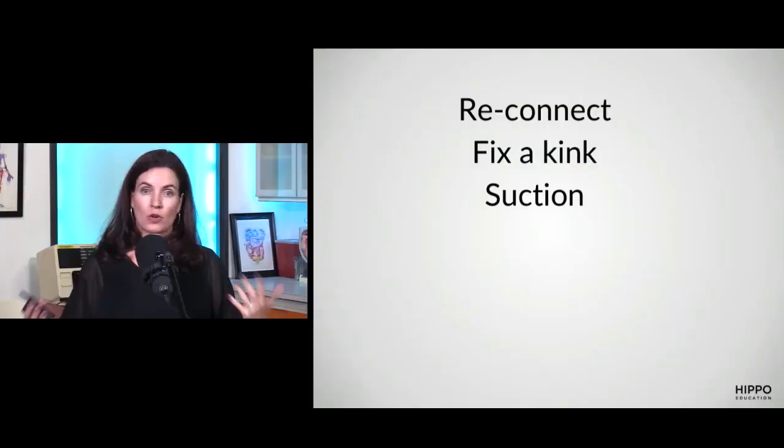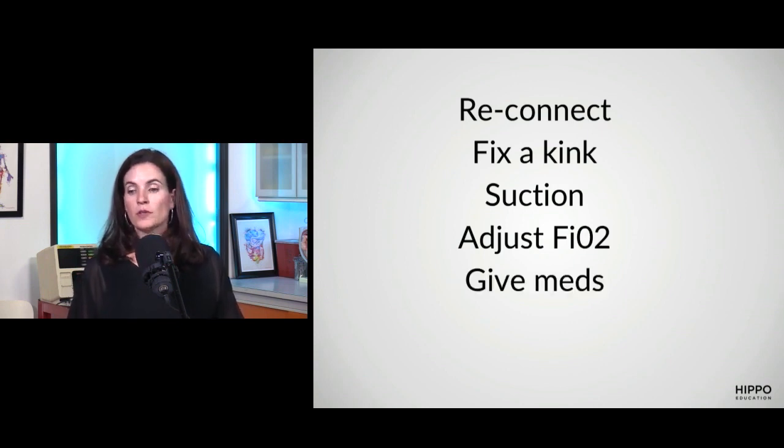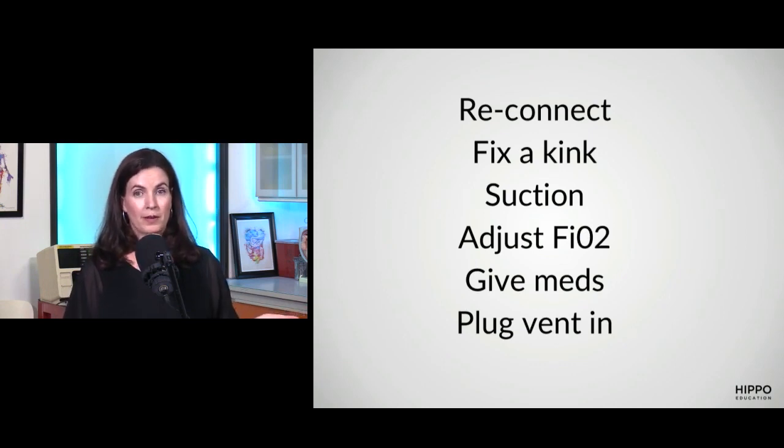Say you see secretions pouring out of their mouth or their endotracheal tube. You could stick a suction catheter down and suction that. You could say, hey, that sat's low, and dial up their FiO2. You could see that they're coughing, they're bucking, they're awake. Hey, I need to give them some sedation. That's going to take your order anyway, so you can enter that order and get that done. Sometimes the patient's just come back from CAT scan and nobody plugged the vent back in, and it's alarming because it's low battery, and then you can do the hero move of plugging it back in.